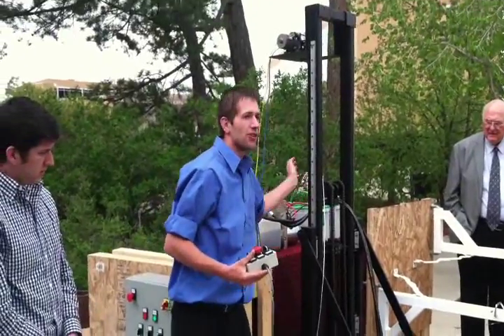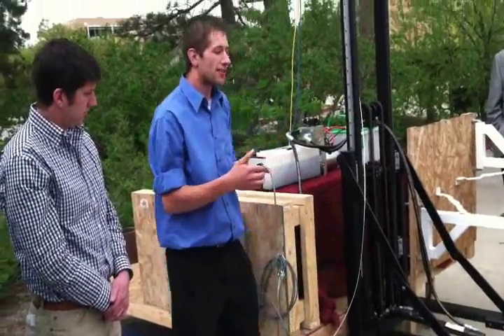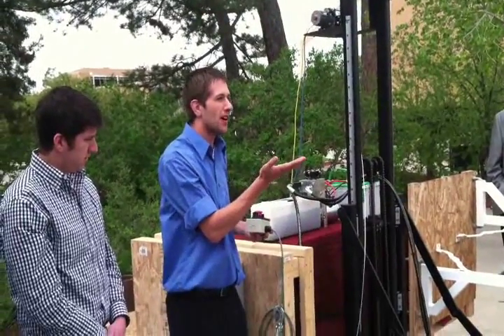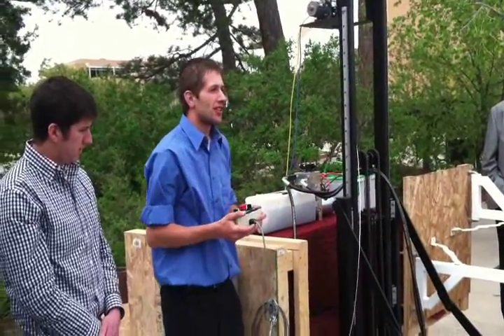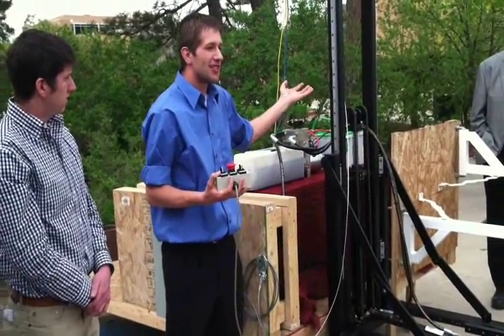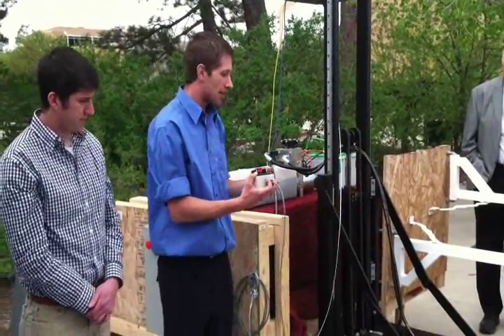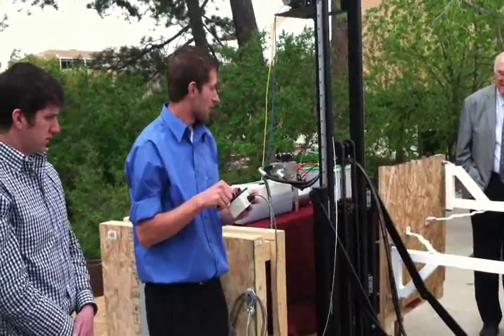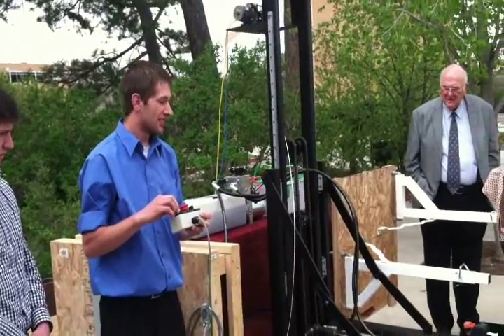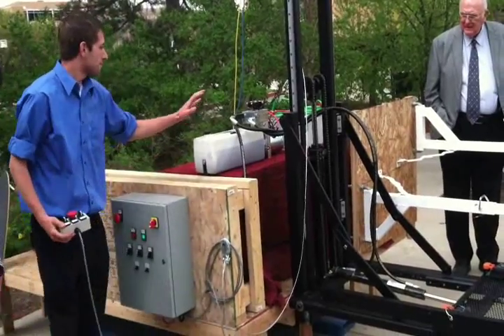The vertical cylinder uses a chain which allows the platform to rise twice as far as the stroke of the cylinder. By doing this, it puts more force on the cylinder, but that's not a concern because the cylinder is designed to lift far more weight than whoever would be on the platform. You can see it goes up and down.